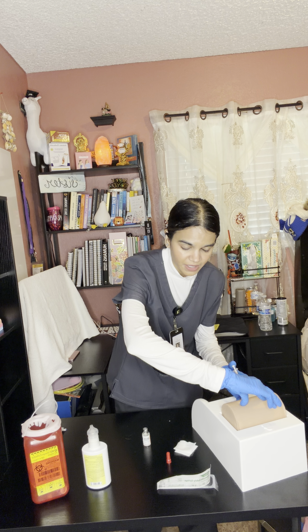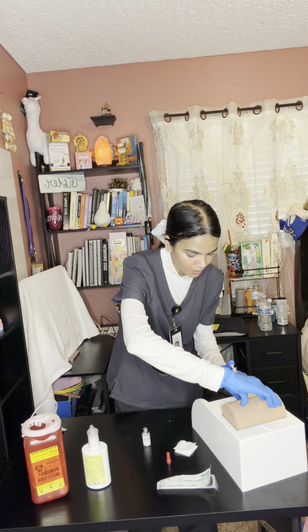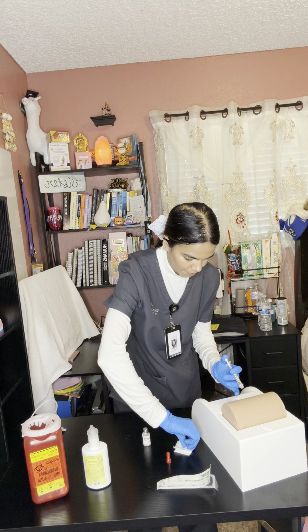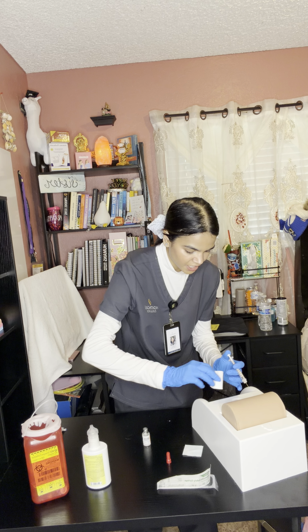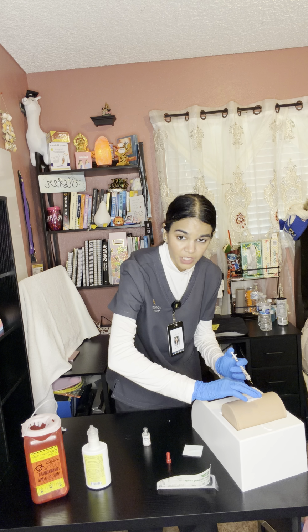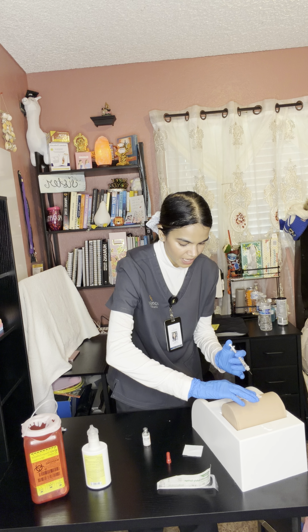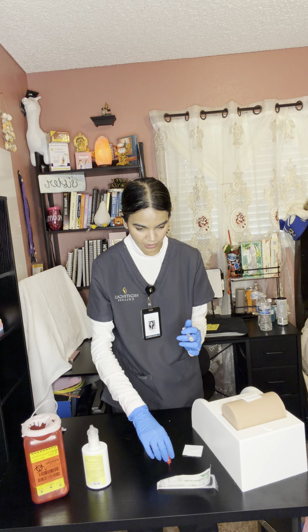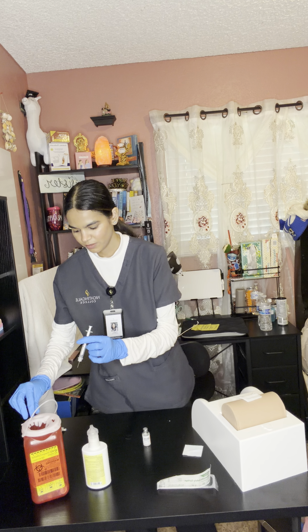I will begin to take the needle out, and I will get my gauze and gently put it over the site, not applying any pressure. I will then dispose of my syringe in the sharps container.